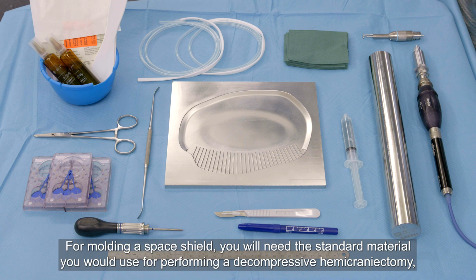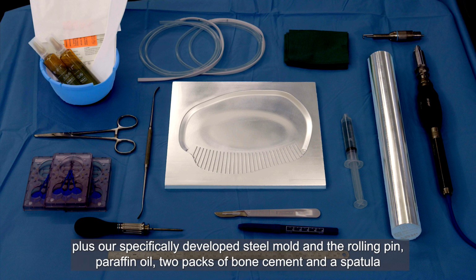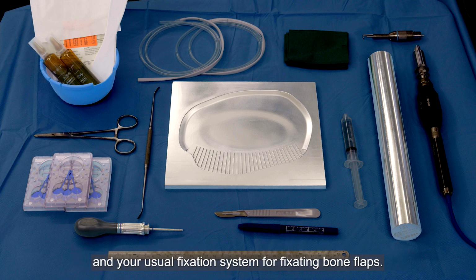For molding a space shield, you will need the standard material you would use for performing a decompressive hemicraniectomy, plus our specifically developed steel mold and the rolling pin, paraffin oil, 2 packs of bone cement and a spatula, your usual fixation system for fixating bone flaps.